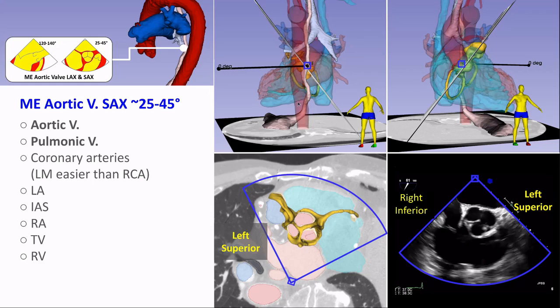We start imaging at the aortic valve short axis, obtained at somewhere between 25 and 45 degrees — though all angles are approximate. Here we see the aortic valve in short axis and the pulmonic valve in long axis. This is a good view for imaging the coronary arteries, with the left main being much easier to see than the RCA. You can also see the left atrium, right atrium, interatrial septum, tricuspid valve, and pulmonic valve.